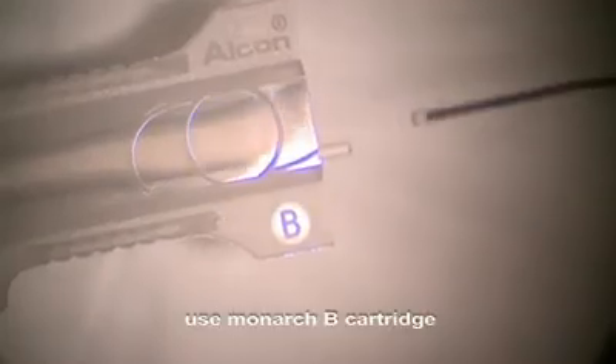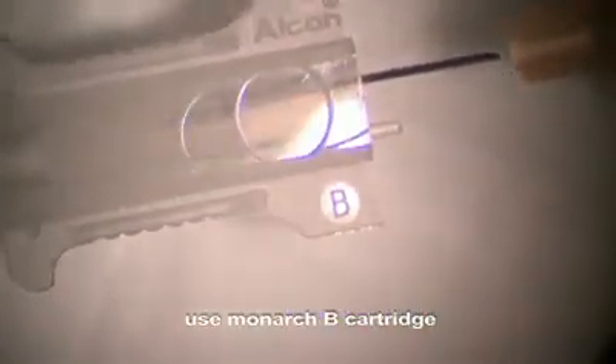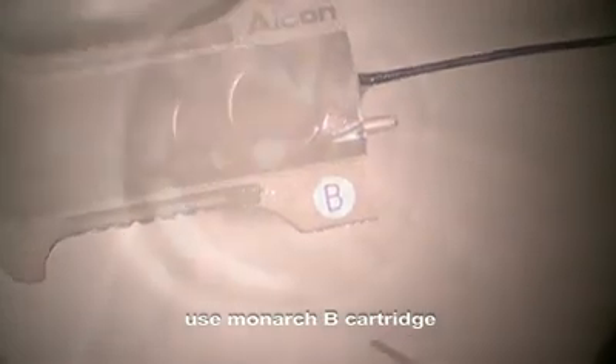You really don't want to have these haptics in the middle of the optic — you have to be very careful. Here's the B cartridge, which is what you want to use for this large MA50 lens. Here's the lens as it comes out of the case. You can see it's right side up, but we're going to confirm that before we place it into the cartridge, which is filled with viscoelastic — in this case, OccuCode.